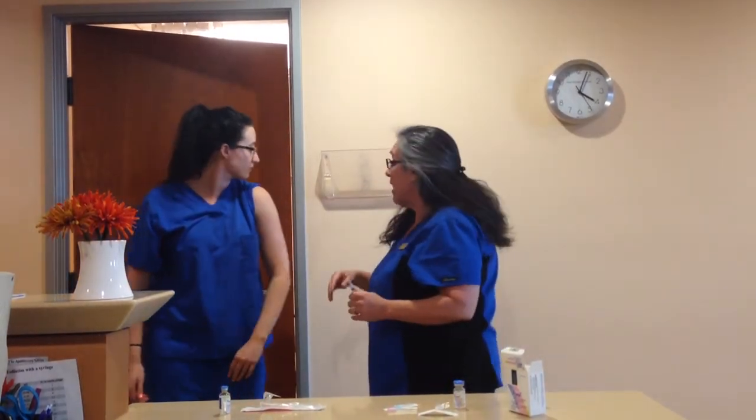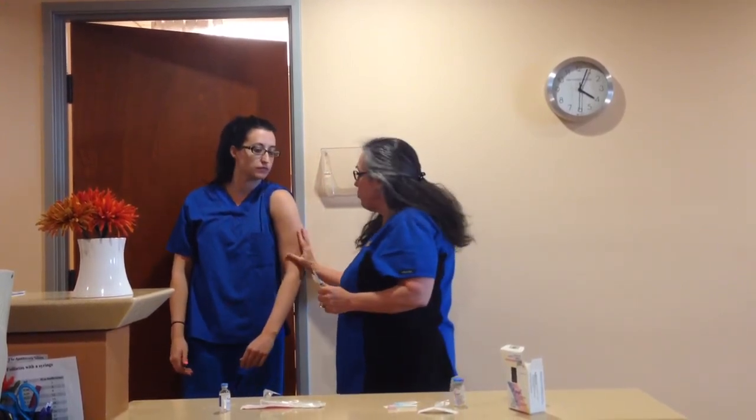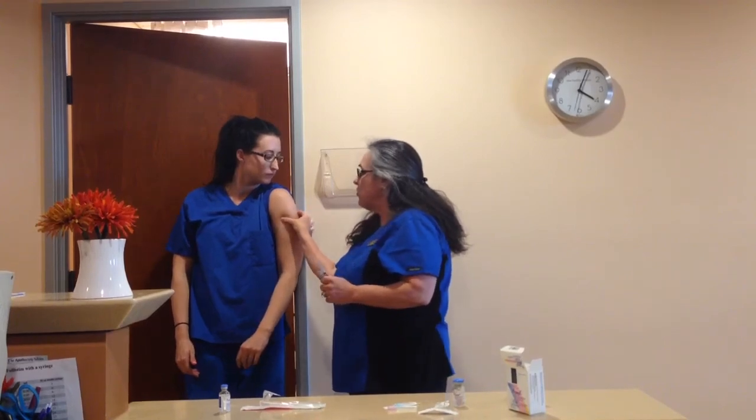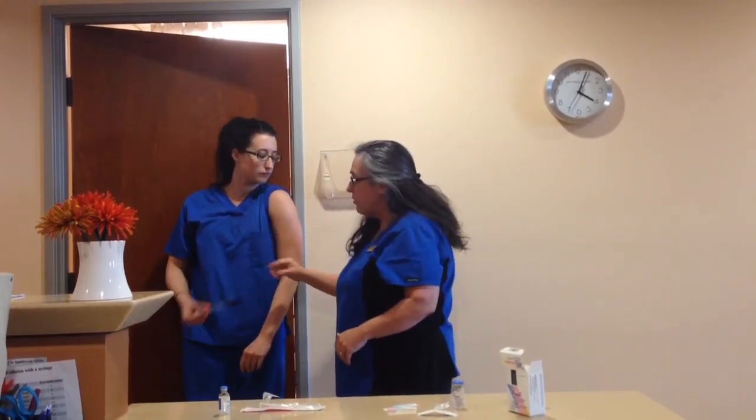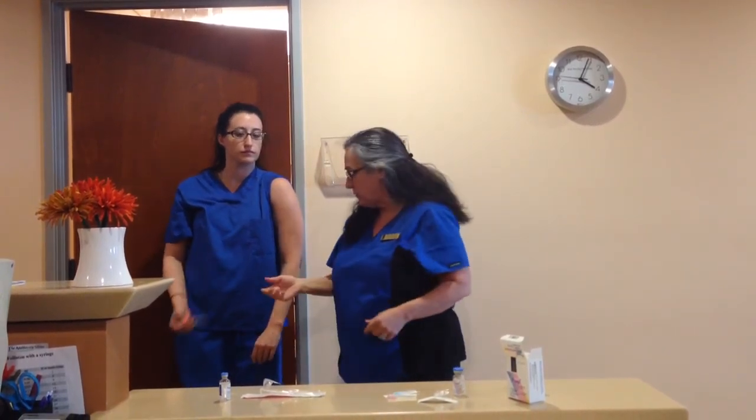Sometimes you don't have somebody to help you, or you're the kind of person who wants to do everything yourself. There is a way you can do it alone. I'm going to have Sam demonstrate. Find a doorway or a corner of a wall — push your arm up against it so you're bulging the muscle out a little bit right here. Then you can use the syringe yourself and simply reach around. You don't have a set of hands to pinch it up, but you can use the corner of the wall to push it up a little bit. Injection done.